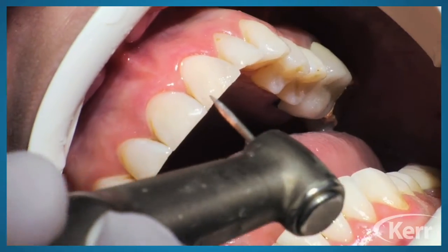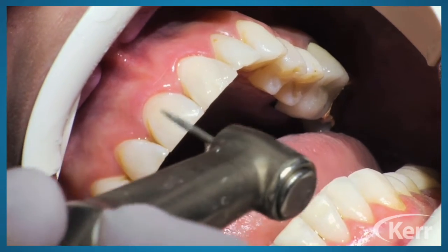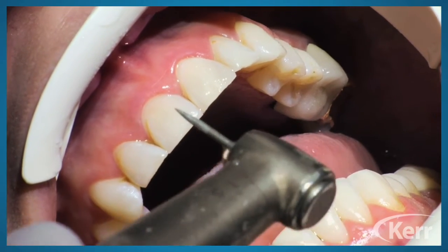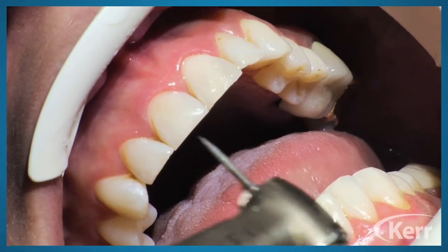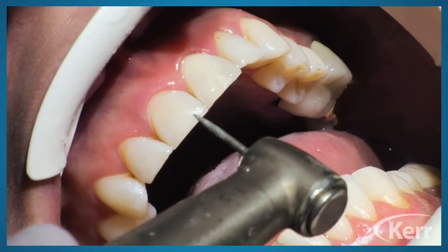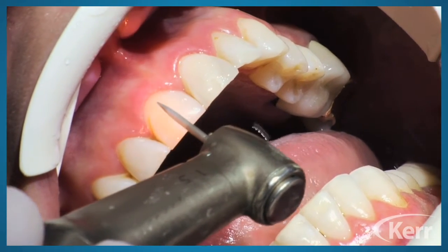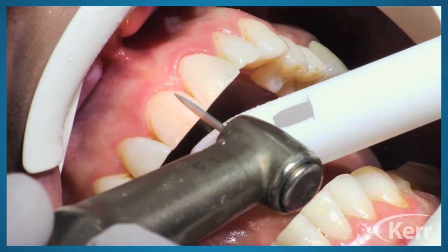I just see a little bit of marginal irregularity that I don't like in this restoration. It's very small, so I'm going to go back to a yellow striped diamond just to get it just a little more flush with the tooth, even though you could see with the Explorer it was very nice already. But I could just see in my loops some irregular surfaces that I just want to smooth up. Little water, Edwin, please.